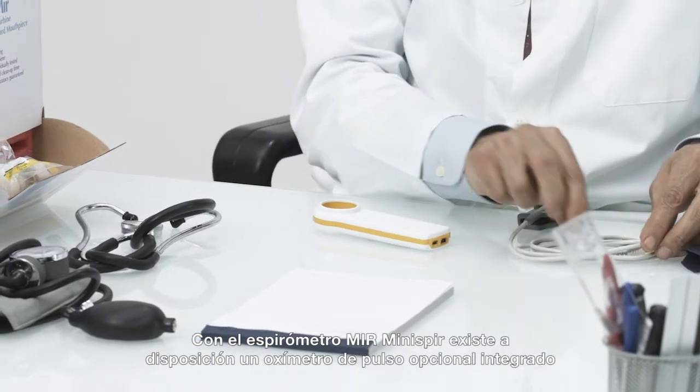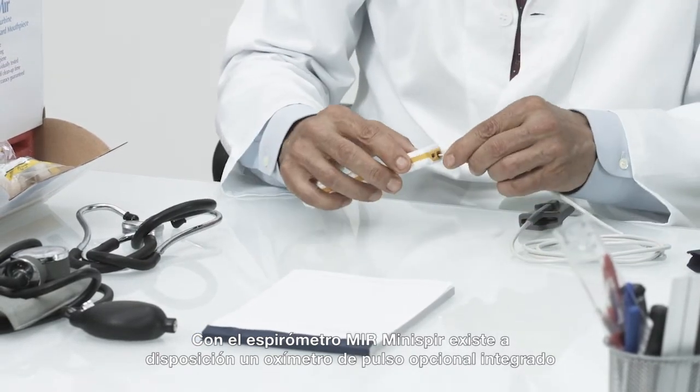Also, an optional integrated pulse oximeter is available for the MIR Mini Spir spirometer.